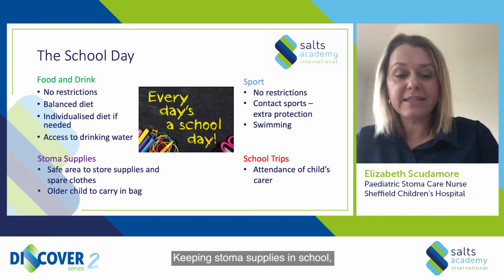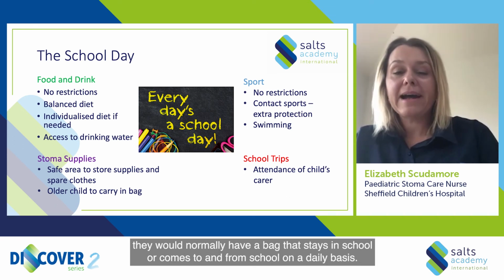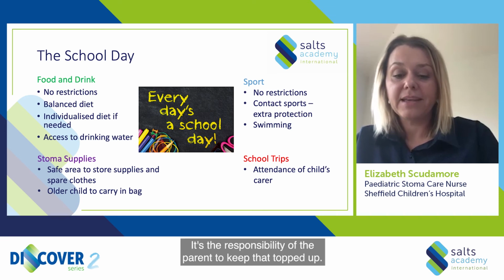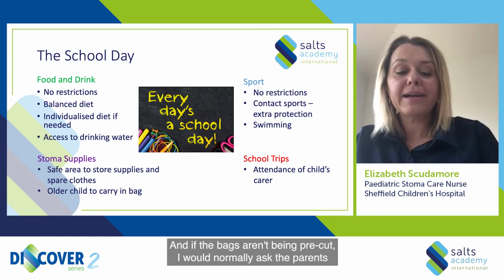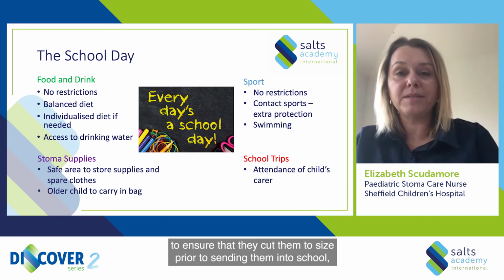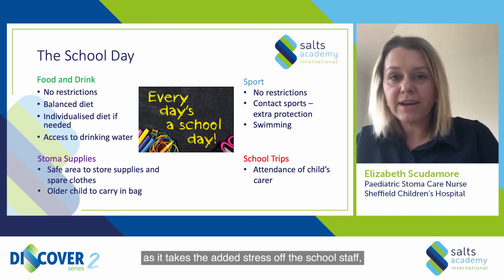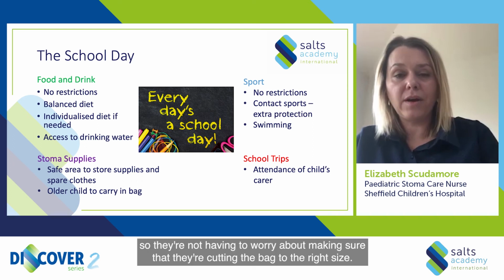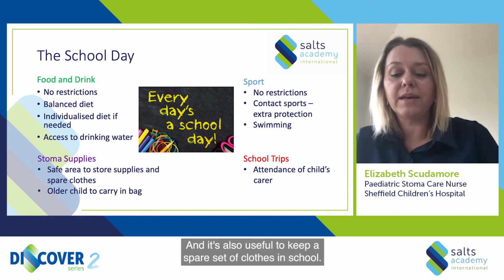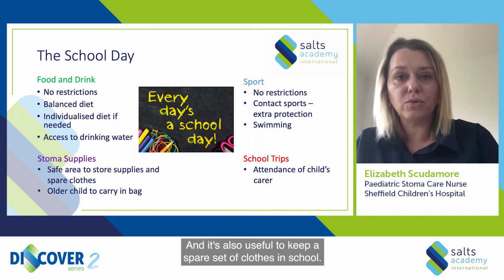Keeping stoma supplies in school. They would normally have a bag that stays in school or comes to and from school on a daily basis. It's the responsibility of the parent to keep that topped up. And if the bags aren't being pre-cut, I would normally ask the parents to ensure that they cut them to size prior to sending them into school, as it takes that added stress off the school staff. So they're not having to worry about making sure that they're cutting the bag to the right size. And it's also useful to keep a spare set of clothes in school.